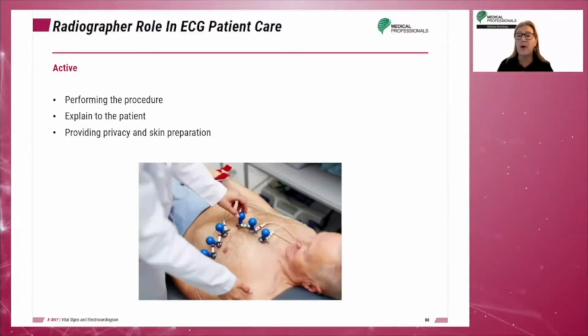Technologists may be required to perform an EKG. Before performing the procedure, the technologist should explain the procedure to the patient. Electrode placement should be done while ensuring the patient's privacy.